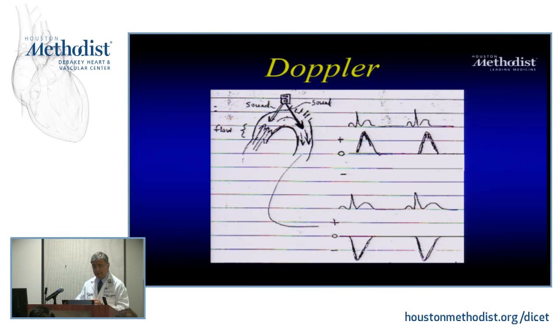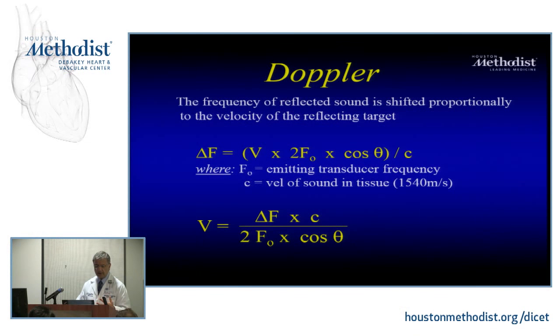So, the other thing, let's take an example. This Doppler equation has an interesting thing: this is the frequency shift we just talked about. It's related to the relative velocity of these objects, to the emitting frequency, and to an angulation, cosine theta.